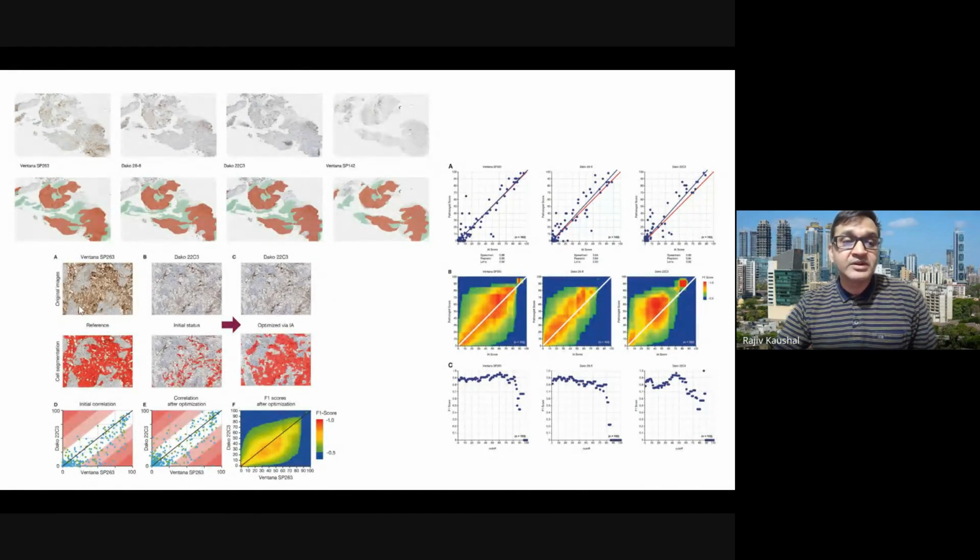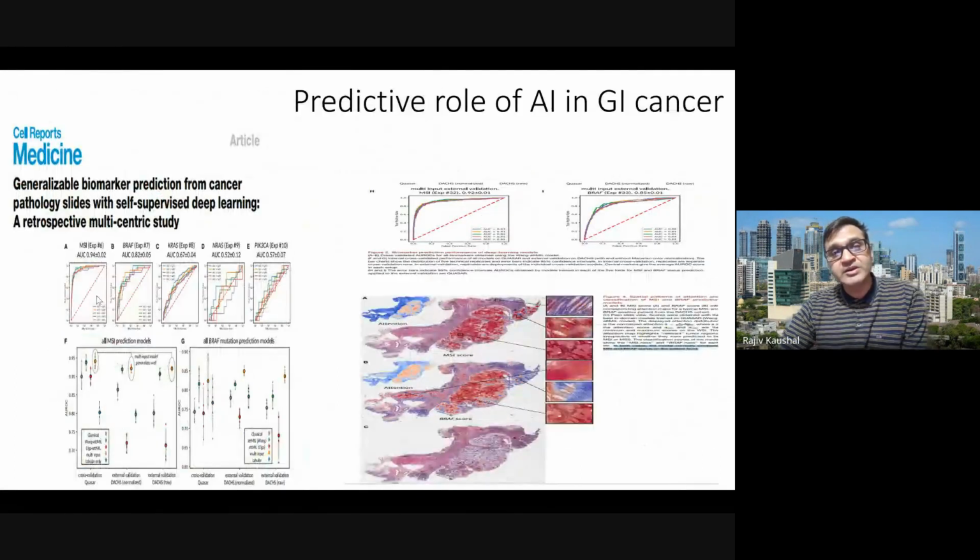And as we know, for PDL1 there are various stains with different clones, like Ventana SP263, which is a brighter and crisper staining. So for using these stains, the algorithms give more precise results, but time will tell about the maturity of these algorithms in clinical practice for PDL1.